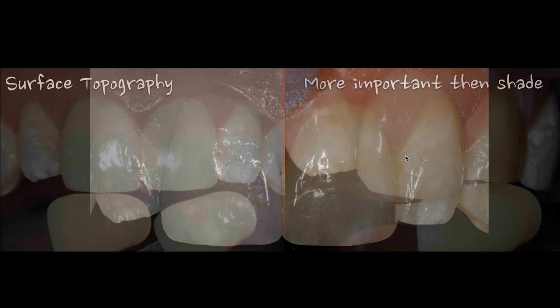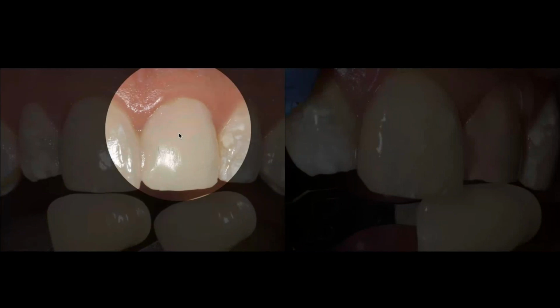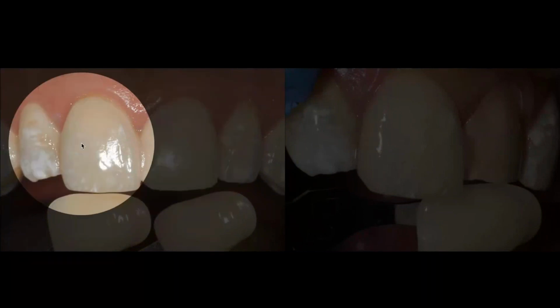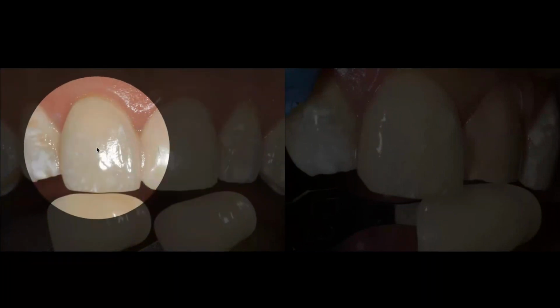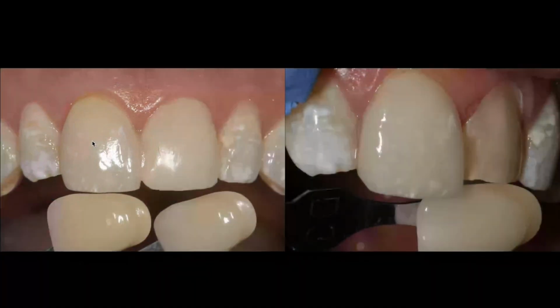So this particular case was interesting, and I won't bore you with the whole history of this case. It's a really old case, but what's interesting is the doctor had sent me this case originally asking me to make one central. I think it was this number 9 he wanted me to make. And I was kind of like, you're kidding me, right? I'm not going to match that to what I consider a pretty bad restoration on the number 8. And he said to me, well, the patient only wants to pay for one. And, again, long story, I'll kind of avoid it.